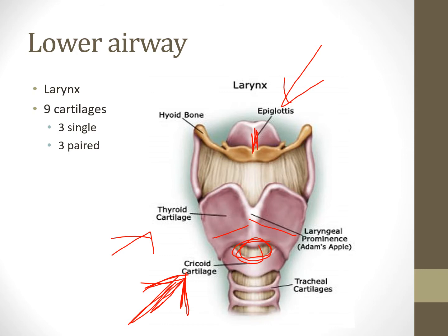And then obviously we would do a trach. A tracheostomy is usually between the second and third tracheal rings down here. So it's lower, and there's a lot more space in these tracheal rings than there is in that cricothyroid membrane, so we can use a tracheostomy tube with a lot bigger volume of airway, which according to Poiseuille's law means we can ventilate a lot more efficiently and reduce airway resistance, right?